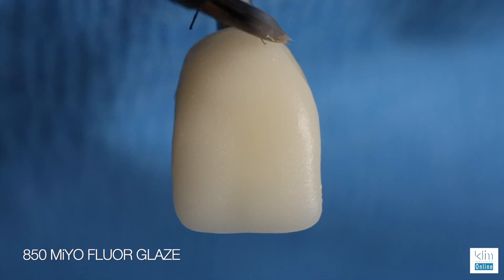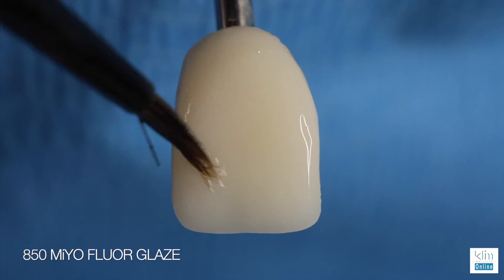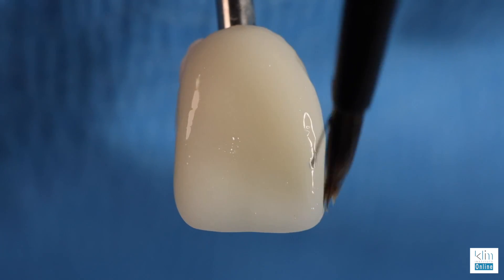Mio glaze. This is the secret about 850 — it's magical. Once this restoration fires, the glaze looks like natural enamel and gives it that nice luster. Just keep it thin, particularly on the incisal edge.